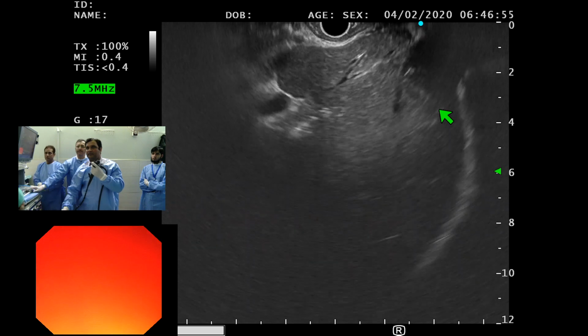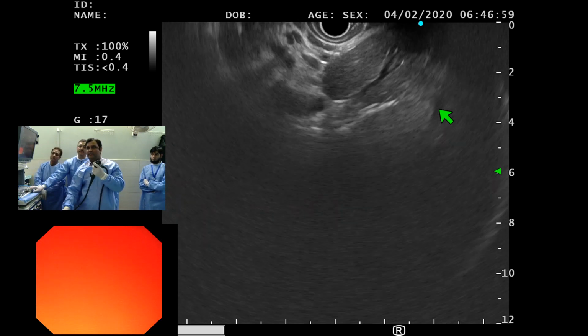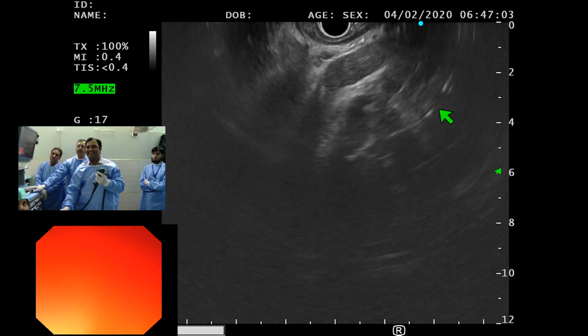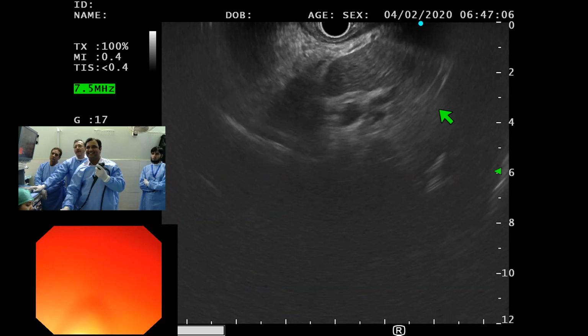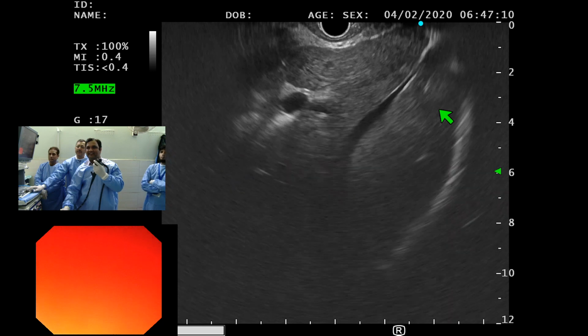To be honest, I have not seen any abscess in segment 1. Radiologists have got special eyes to pick up the things. My approach is just like Dr. Saad, pick up the major things, forget about the minor things.